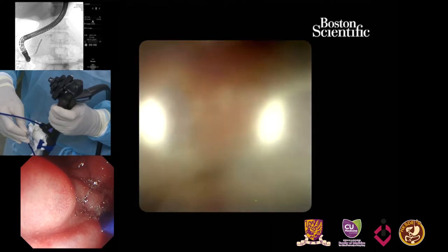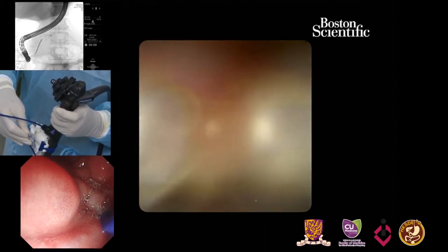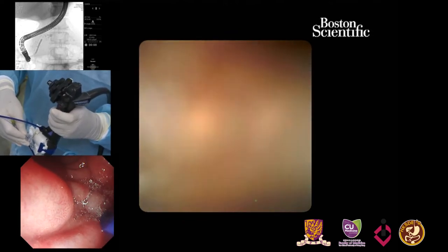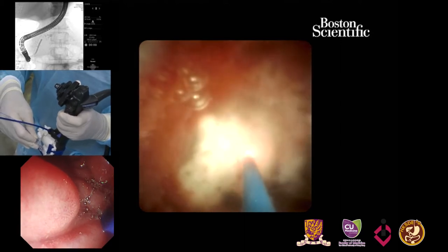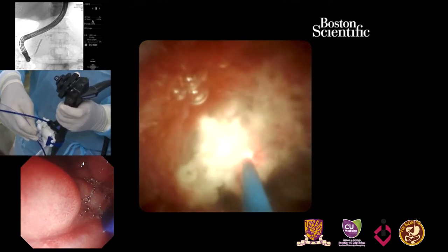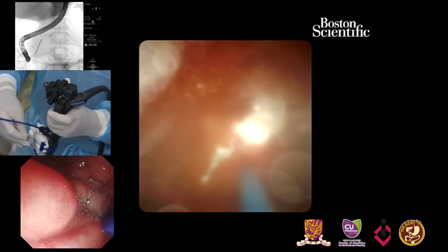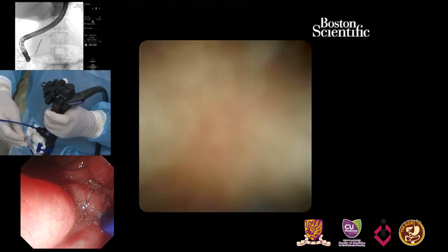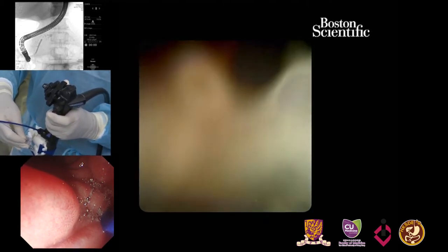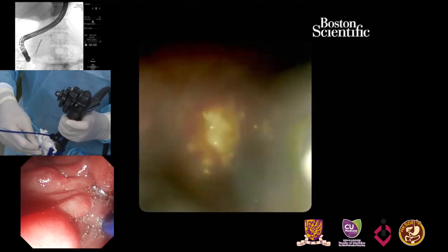And you can see it's taking some blasting to clear the stone, so hopefully he won't need another workshop. Since you're seeing a good effect, you're not going to adjust your settings? You would only adjust them if you saw nothing. If I find that it's not very good, then I'll adjust them. The other important thing is that as you're blasting the stone, you might have to keep continuously putting in some fluid, so that the fluid medium acts as the shockwave transmitter in these cases. So we're actually boring through the stone now.